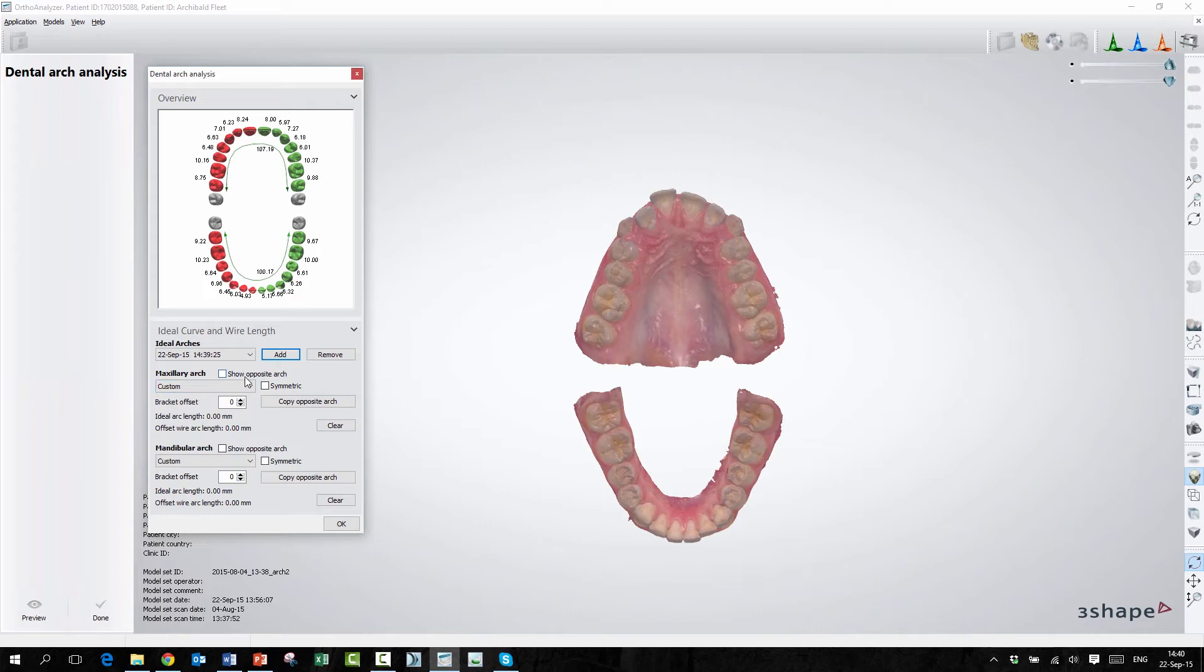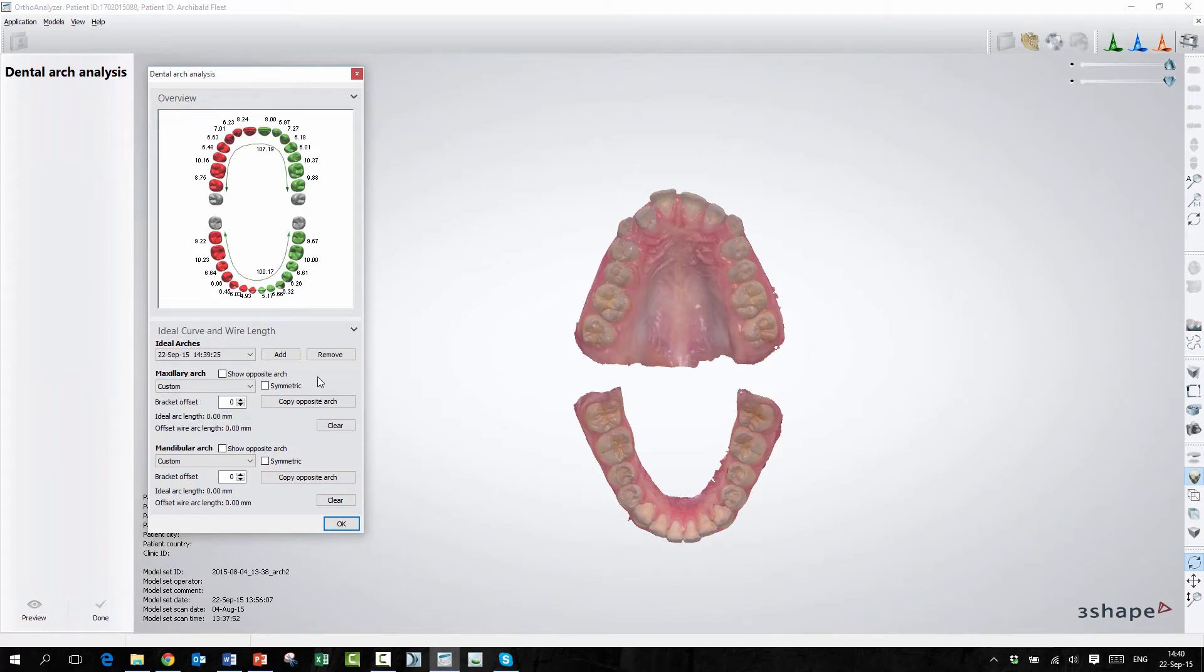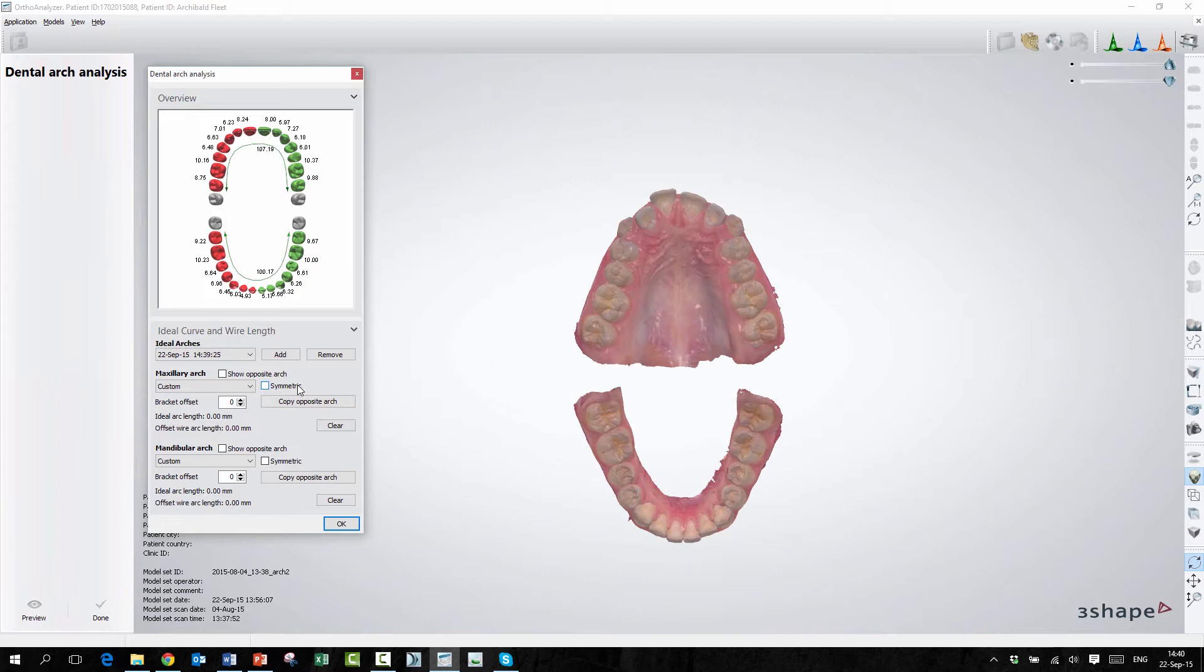So here we have some options. We can choose an ellipse-formed arch, a parabola-formed arch, or we can make our own as a custom arch. So if you want to make an arch, I can also choose symmetric. And before we can use the symmetric tool, it's very important that you have created some standard planes in the beginning. If you haven't, the symmetric feature will not work for you.